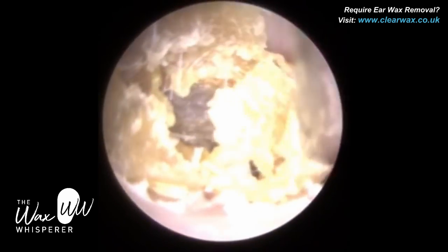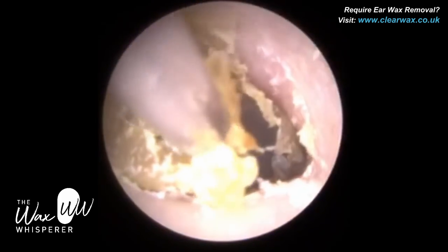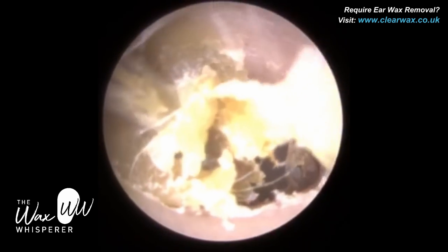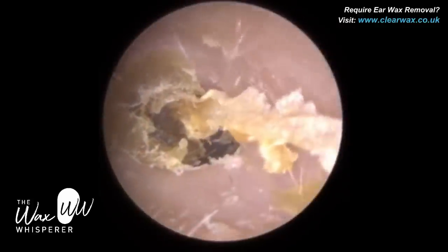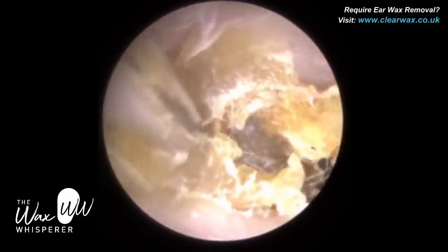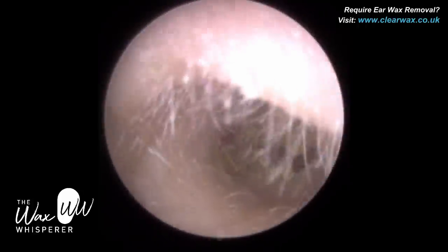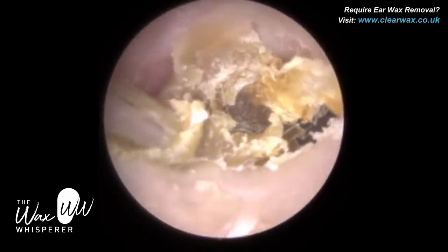You will see me re-enter the ear using some crocodile forceps, but the forceps just shredded this dead skin into little pieces, so it didn't extract much. I'm using the fine end going to the roof of the ear canal, trying to detach this thick layer of skin from the superior aspect. I'm now trying to loosen this skin anteriorly from the anterior canal wall. Similarly to the left ear, this patient's ear canal entrance was a bit narrow, which can sometimes restrict the range of movement inside the ear.